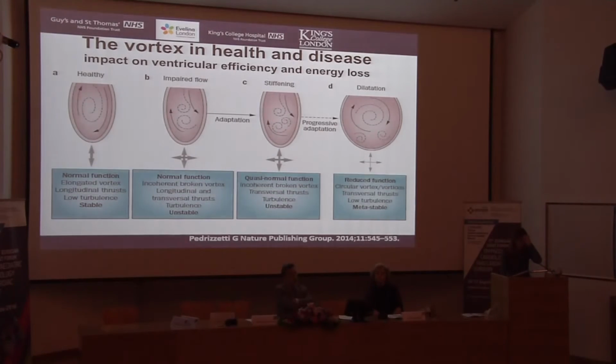Now, it is just recently that in research practice we have new information to suggest that we can detect early functional changes by measuring intracavity flow and vortex formation, because these can have an impact on ventricular efficiency and energy loss. In this diagram, you can appreciate the differences in the flow during ventricular remodeling. In the first picture here, a healthy ventricle with normal filling and normal emptying has regular flow, there's no turbulence, and we have what we call a stable situation.